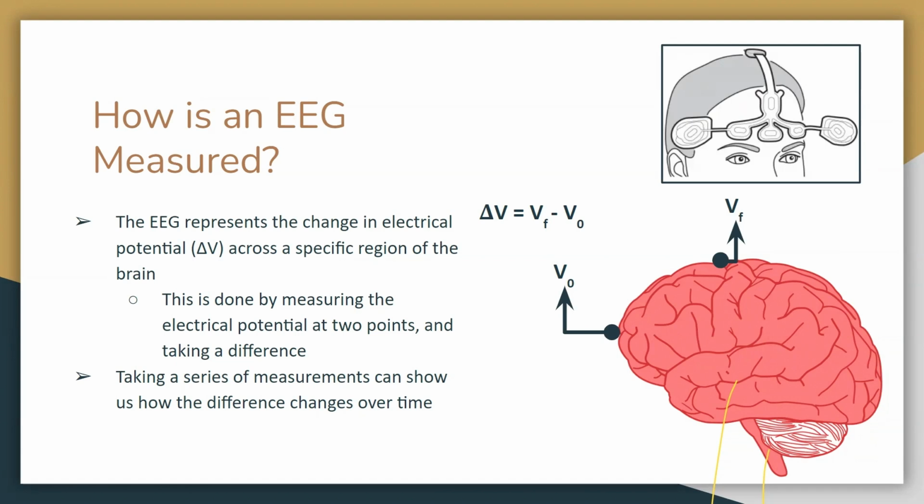So your decibel change in the elderly is because of the water content in their skin? Can it be? I would expect that the brain is actually outputting a smaller amount of electrical power too. I would expect that would be more indicative because, basically, a factor of 2, if the skin is half as conductive, would only be a 3 decibel change. Factors of 2 wind up being 3 decibels in decibel space, so it would be a very small change. You'd have to make it 10 times, 100 times less conductive to start seeing significant changes.